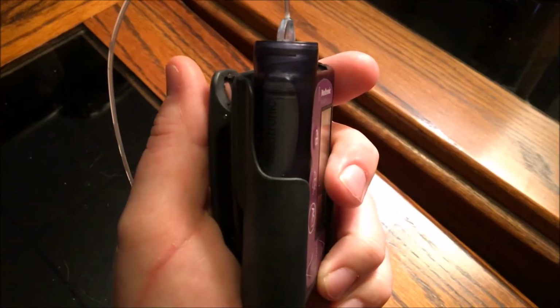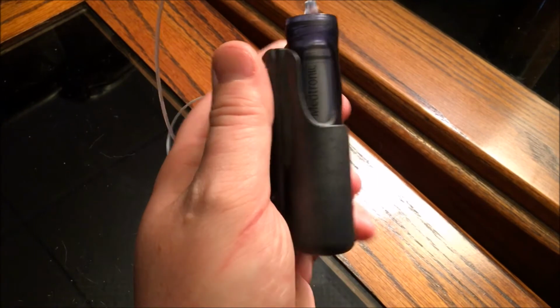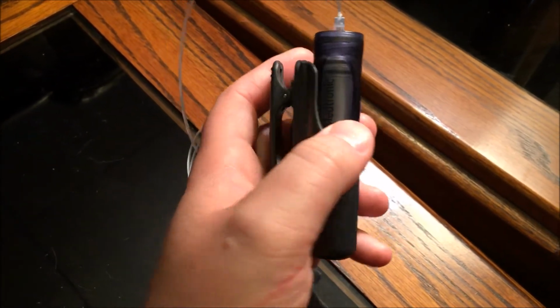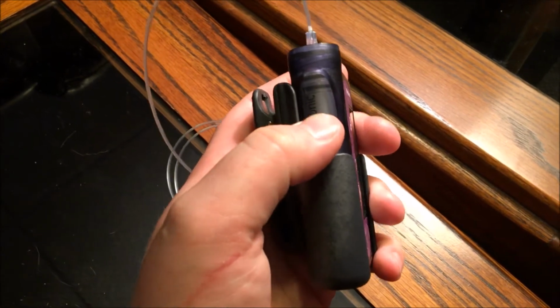Let me show you what I really liked and miss about my old Revel pump and the pumps before that. I've had these pumps since 2001 up until, you know, I just got my 670g. So let me show you what I've noticed I've missed off that pump. So one of the first things I've noticed about the 670g or 630g versus these Revel pumps and all the ones before that, Paradigm pumps, is there's a window here on the Paradigm where you can eyeball the amount of insulin left in it.